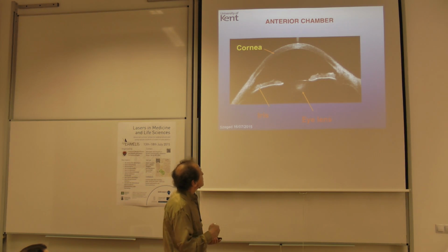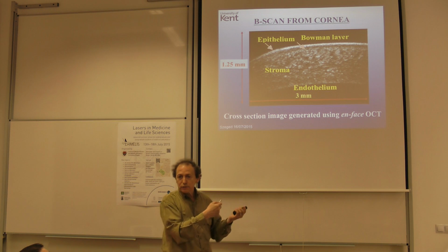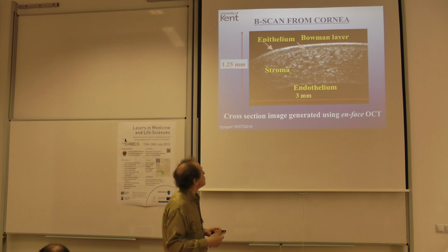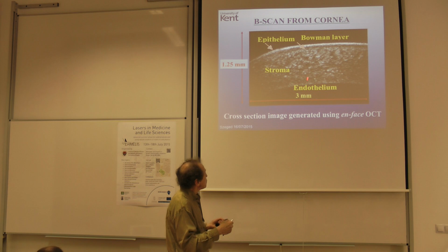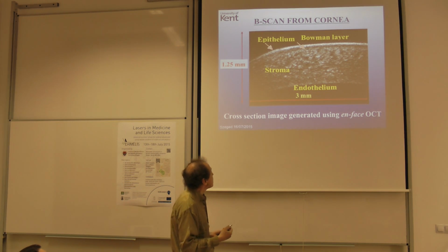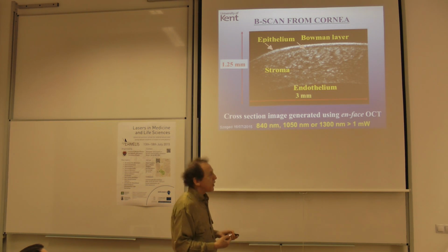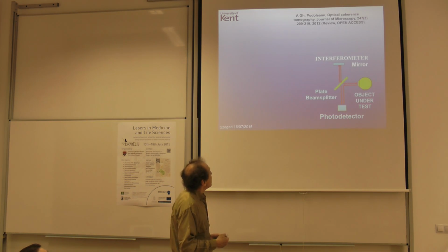images. Applying the technology to the anterior chamber, again you see the cornea, the iris is here, and there are instruments now dedicated for either the anterior segment or the posterior segment. Or if you do a magnification, you see nerves in the cornea. So that is axial, that's lateral. These are images which have an axial resolution of around 10 microns. And there is technology now to provide that 5-7 microns commercial.